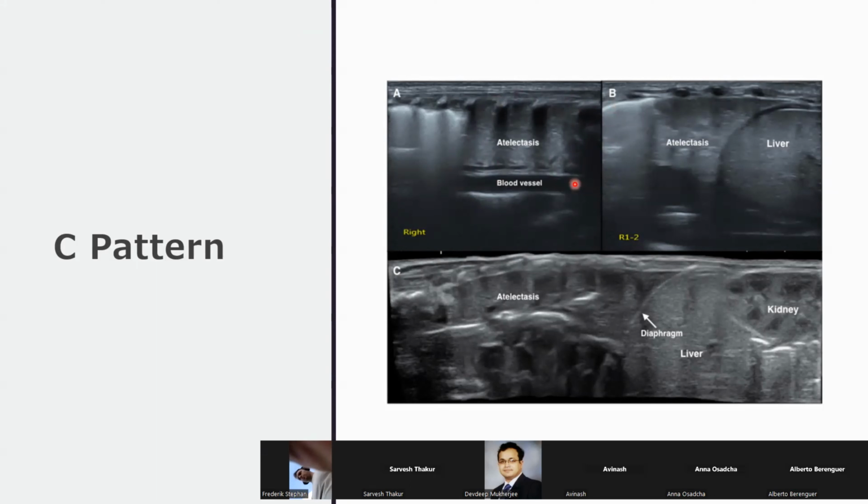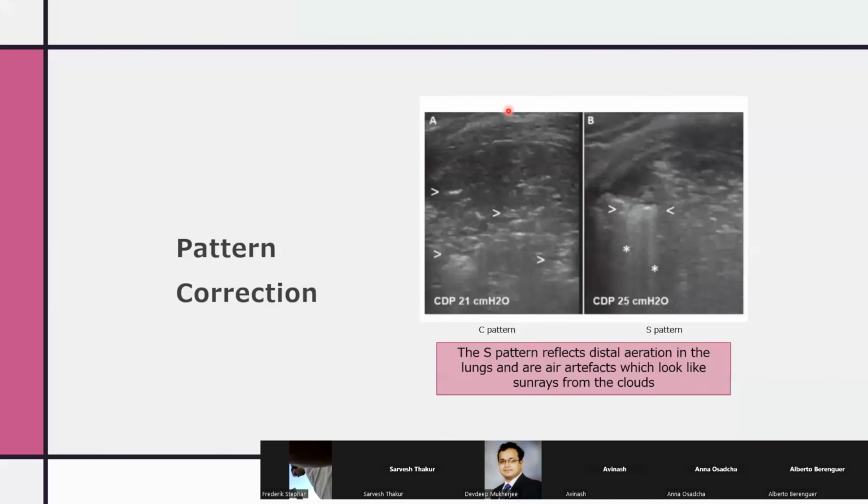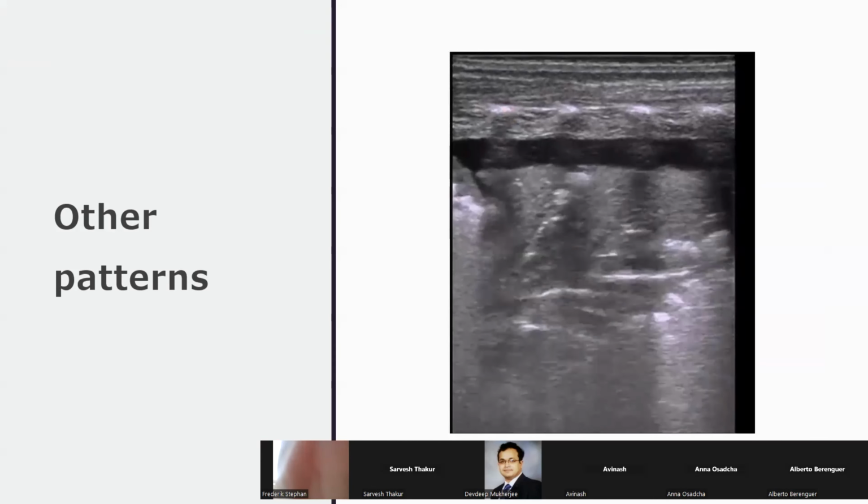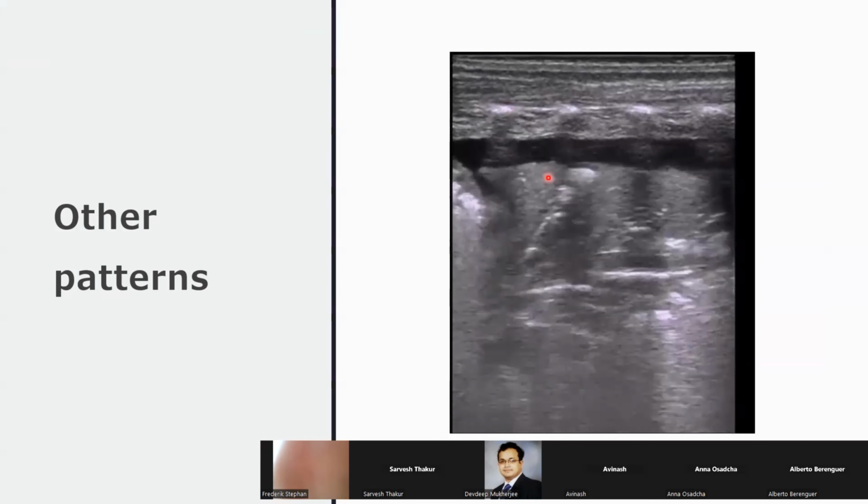On the other hand, if you had an appearance like this after having done it for a while, and or your baby's starting to get worse, my advice would be that your lung-related recruitment strategy is not working. The question that you really need to ask is whether a position change, if the baby is going to tolerate it, a physio-based approach might be better. So again, just an important example of how we're using clinical correlation in these circumstances. But really, this is clearly what atelectated lung looks like.